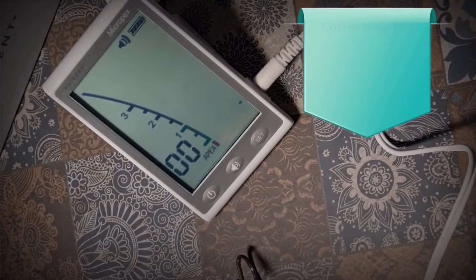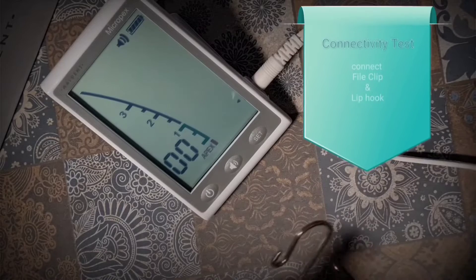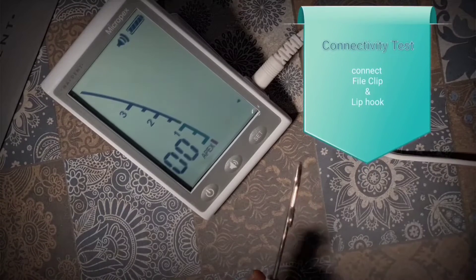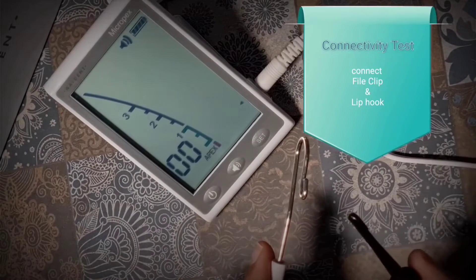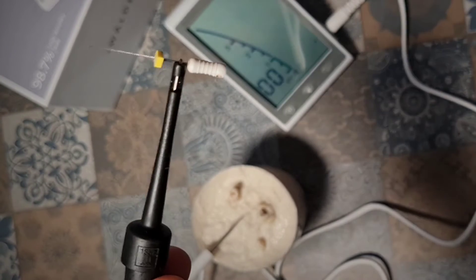Observe the device display — the apex sign will flash. Once you touch the file clip to the lip hook, a short circuit is completed and the number minus 3 is displayed on the screen, and a rapid beep sound is produced. This means the device is working properly. Test the device every time before you use it.